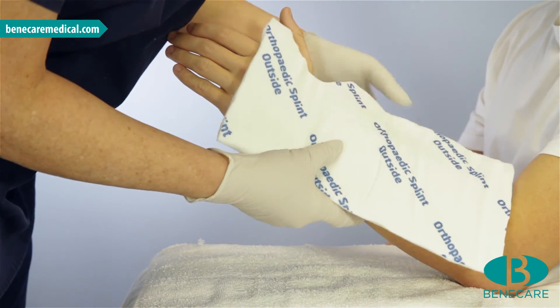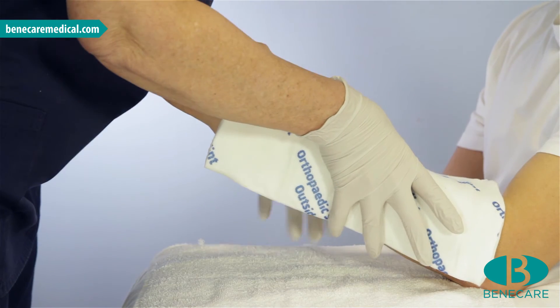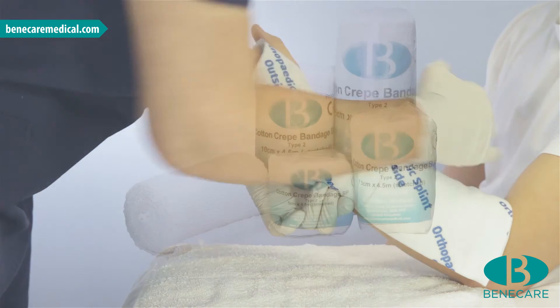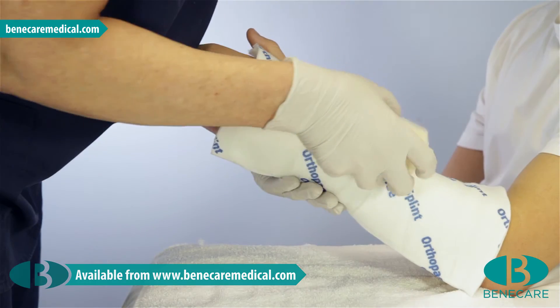Position the splint directly onto the limb with the white felt next to the skin. Mould into shape, and secure onto the limb using the Benicast cotton crepe bandage you used earlier to measure the limb.